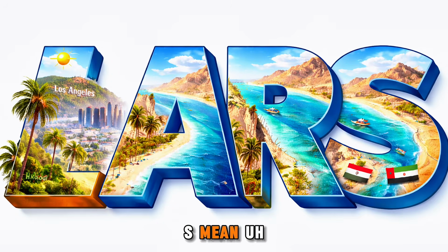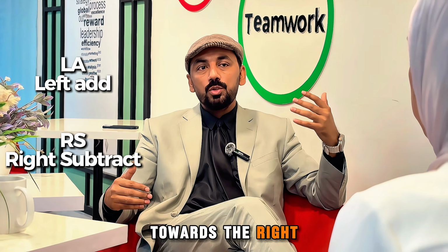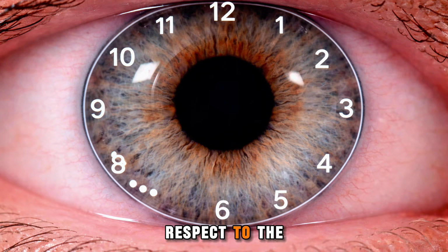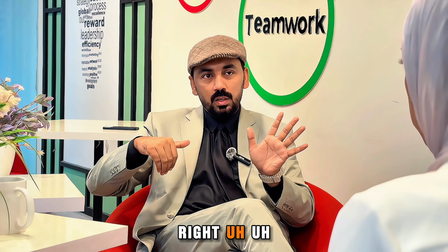This is called the LARS rule. LARS means LA and RS. LA means if the rotation is towards the left side, we will add: left add. And RS means if the rotation is towards the right side, we will subtract: right subtract. So if the rotation is towards the left side with respect to the practitioner, we will add the axis. And if the lens rotation is towards the right side, we will subtract the axis.